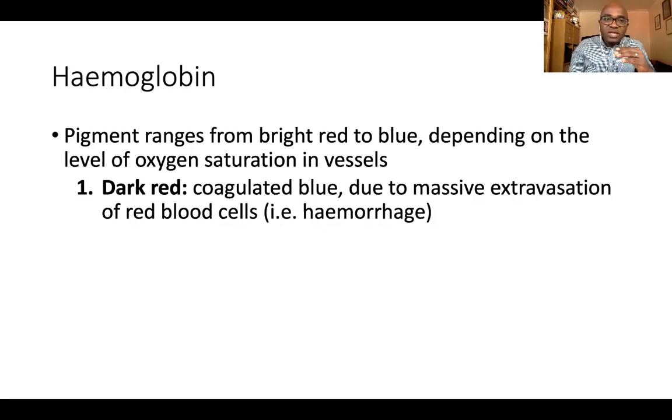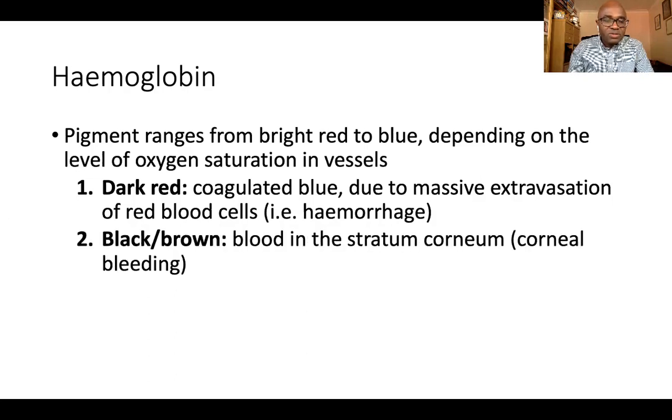Also, when you see blood or hemorrhage at the surface of the foot, so if you look at what we call the black heel or talon noir, you can see that it looks a little bit dark. So I'm mentioning all these things, but we'll come to some pictures and you'll appreciate what I'm talking about, what hemorrhage or dark red looks like on dermoscopy.